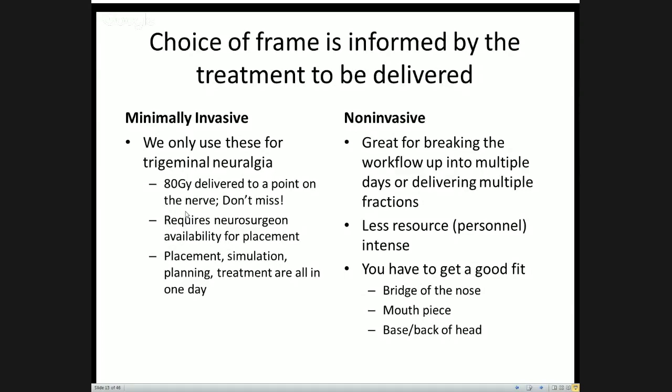There's also non-invasive options. That's great for breaking the workflow up into multiple days or delivering multiple fractions if you take the approach of SRT. It's a little less resource-intensive because you're breaking that up into multiple days. But you have to be especially careful to get a good fit. Check the points of inflection around the face and the head, the bridge of the nose. There's usually a mouthpiece that will go in to help prevent pitch of the patient's head to keep that reproducible. And also checking around the base of the head and the back of the head.